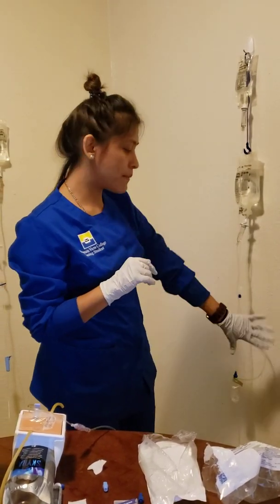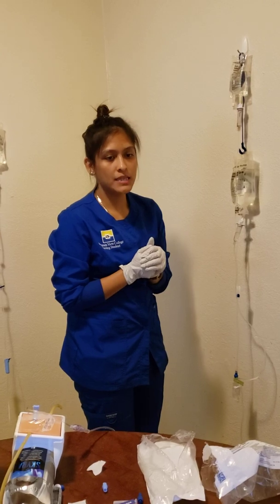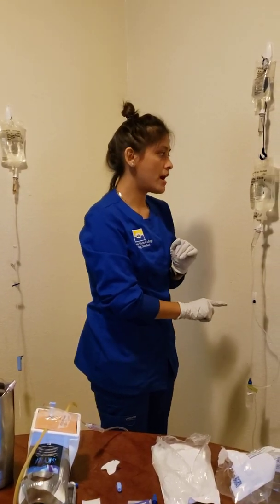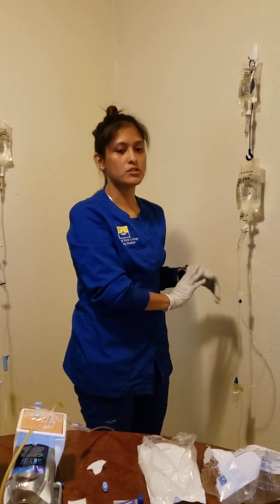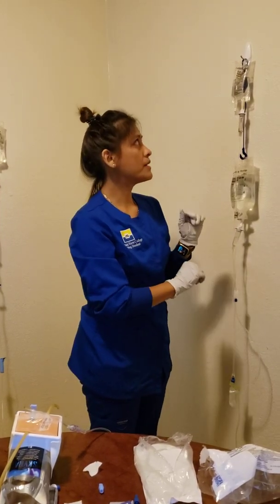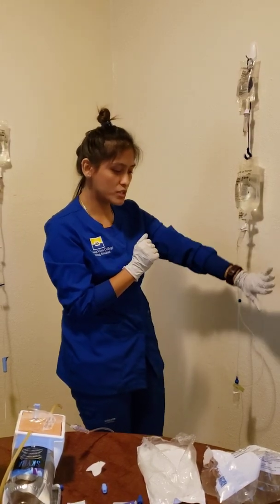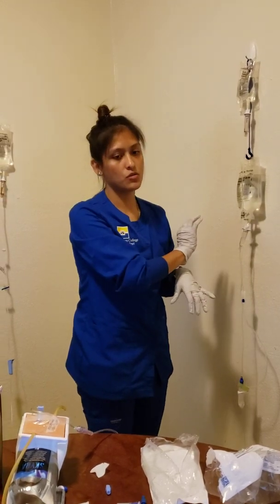So I'm going to program my pump here. I'm going to want to put my primary, which is my saline. I'm going to do 500 ml over 10 hours. So on my pump, I'm going to put 50 ml over an hour with volume of 500 ml. And so that's going to say that it's going to take the 10 hours to give. Then I'm going to program my secondary, and I'm going to put in that I have to give 100 ml over 30 minutes. I'm gonna put in that I have to give 200 ml over an hour with the volume of 100 ml. So then that's gonna go within 30 minutes.